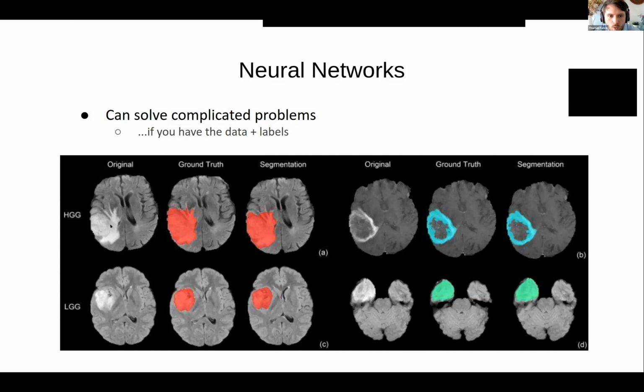These are quite powerful because you don't have to specify a lot a priori. The algorithm can learn a lot of different things about the image. Also, there are special neural networks designed to take into account how spatial information is laid out and correlated. So that's a big improvement on the other simpler techniques we were looking at.